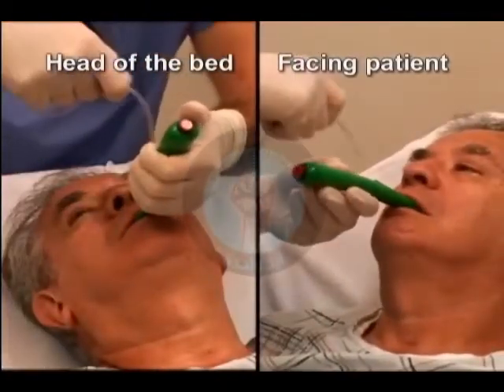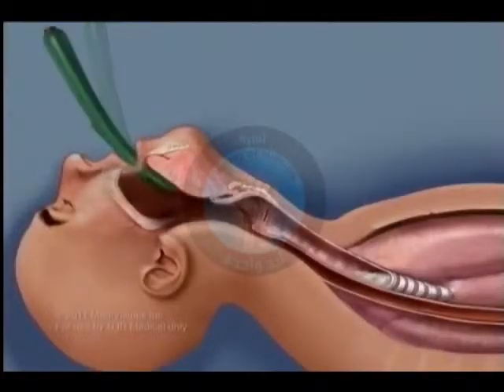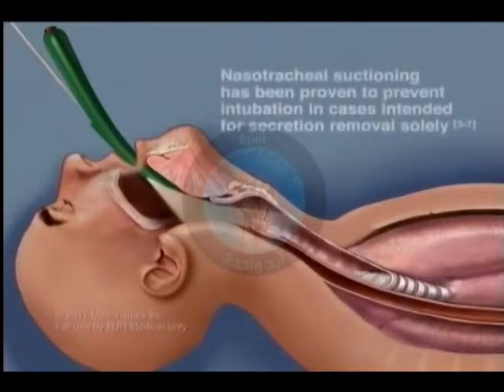Insert the No-Bite 5 into the patient's mouth. Depress the tongue to facilitate opening of the airway. Turn on the light. Insert the tracheal suction catheter into the guide until the desired depth of the trachea is reached, and then suction out secretions.